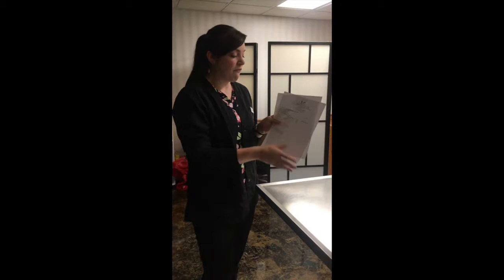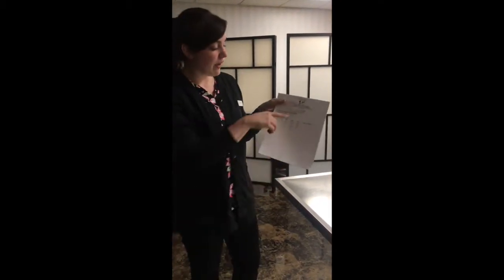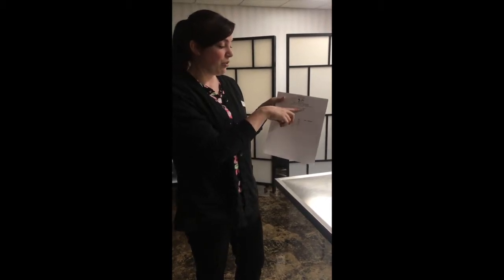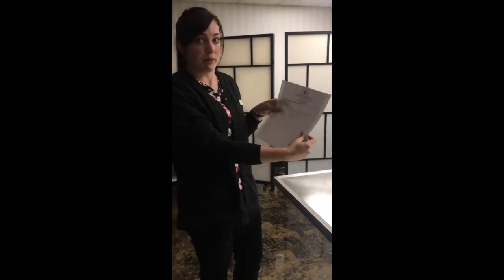Alright, I'm going to be showing you guys our laboratory forms. This is a printed off version of blood work that we did for a patient that we have today. We have the patient's information at top. This was Jack's blood work. We have the owner's name up here, the breed of the dog and the age of the dog, so we know exactly who this blood work belongs to.